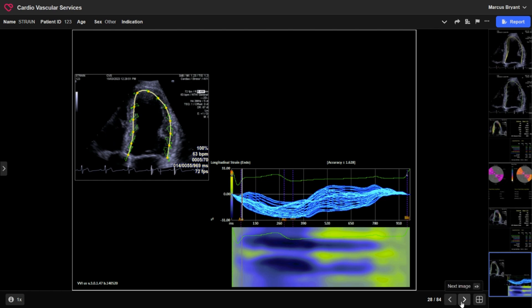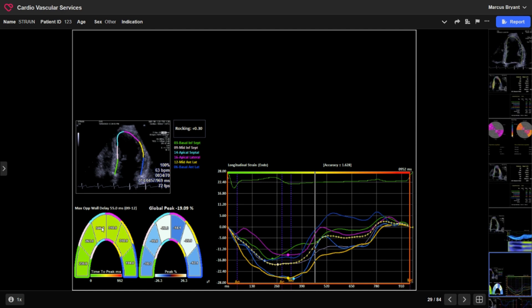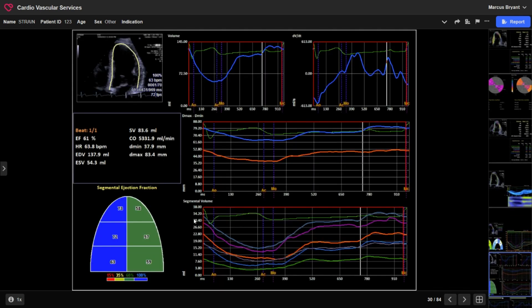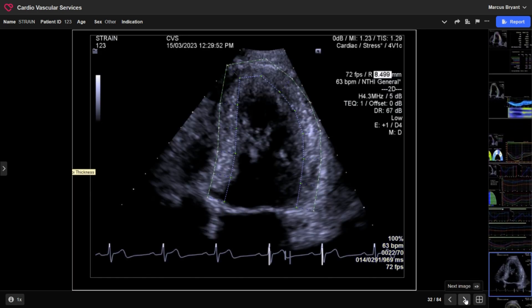There are various other views you can capture looking at different elements. These different waveforms are going to become a lot more important over time because they show when the strain is actually occurring and when the peak systolic strain is happening. For elements relating to revascularization and myocardial infarcts, it will be the timing and the changes rather than the peaks that matter. There are also different sector displays from the graph that can be seen, with further analysis available.